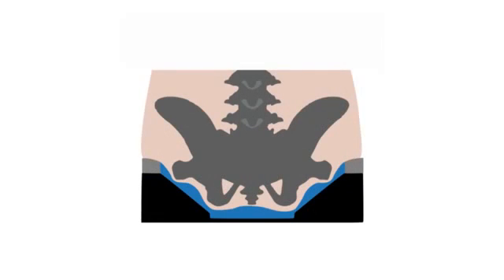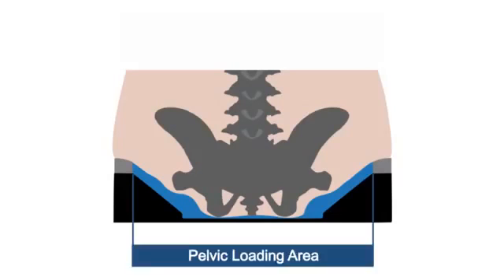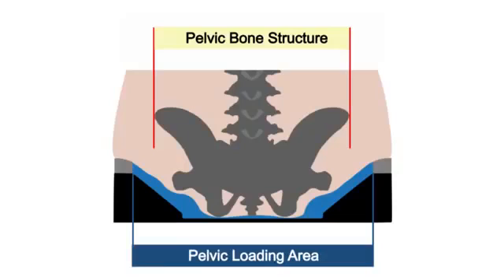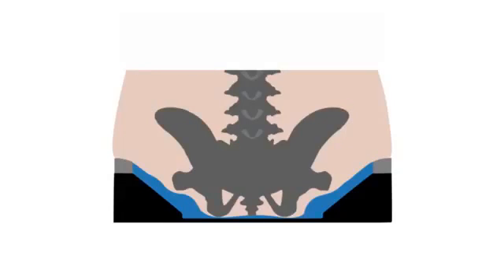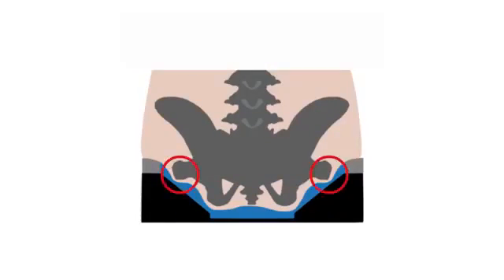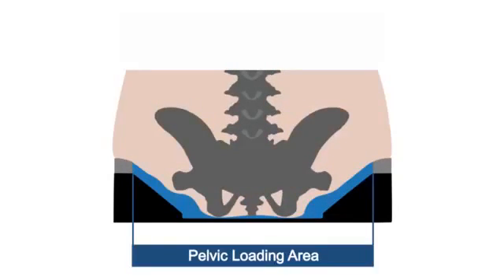However, for some unique presentations, there is a potential risk of bottoming out. This is because the pelvic loading area is actually wider than the user's pelvic bone structure, as wider hip widths tend to be based more on tissue volume than pelvic bone structure. In the smaller sizes, the trochanter bones rest on the PLA, fully suspending the ischial tuberosities in the fluid. If the PLA becomes wider than the trochanters, an unsupported pelvis can sink to the bottom of the fluid pad.